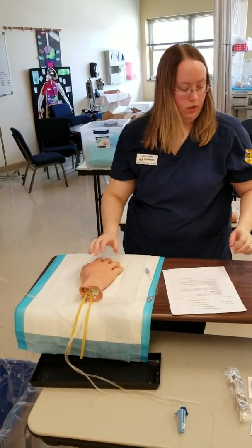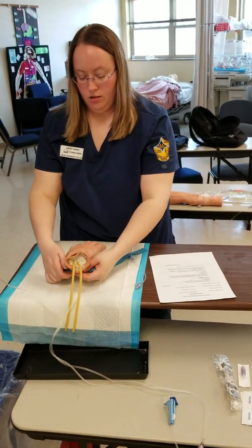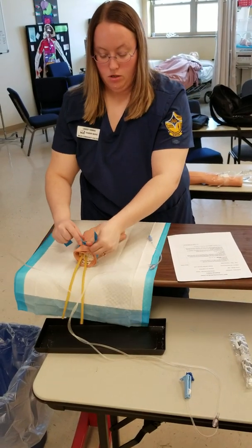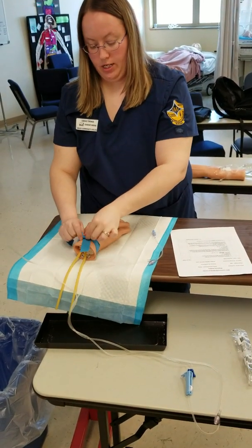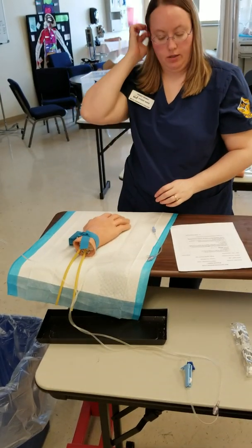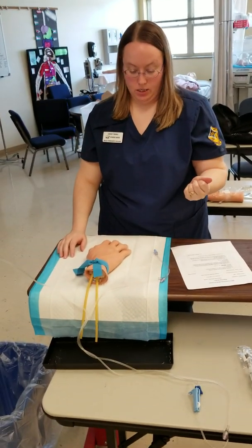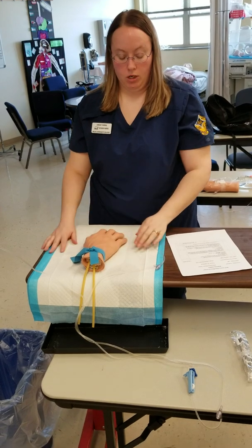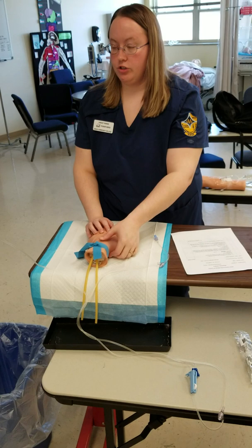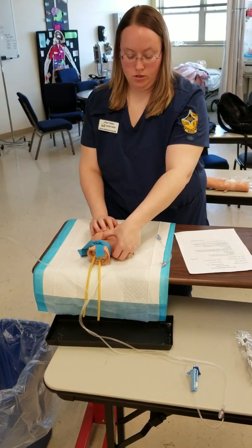I'm going to apply a tourniquet so I can find the right vein about 4 to 6 inches above where I'm planning to insert the catheter. So I would palpate. If I couldn't find a vein that was dilated enough, I would have the patient squeeze their hand or apply a warm compress. I could also gently rub the vein from distal to proximal.